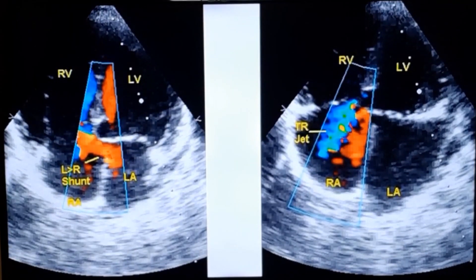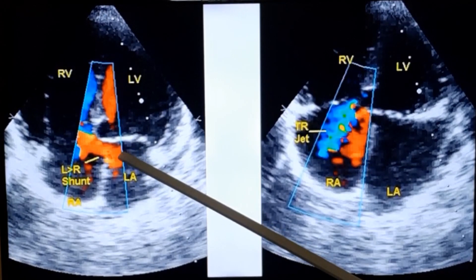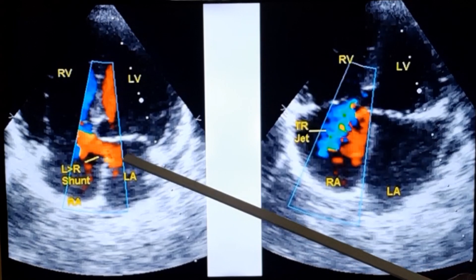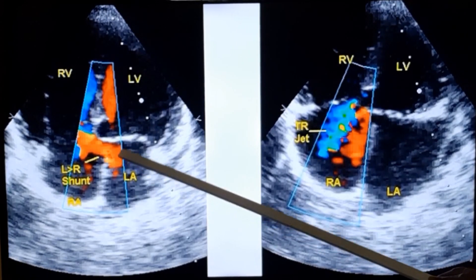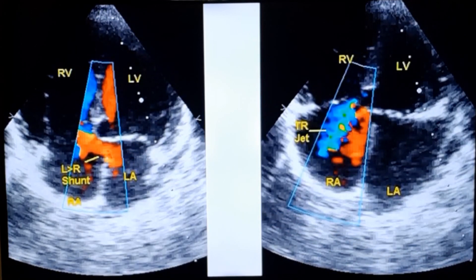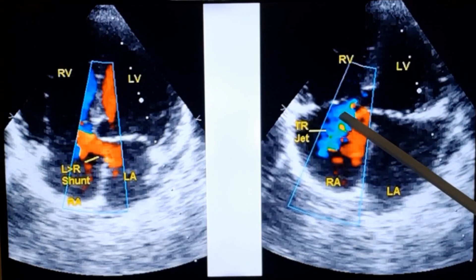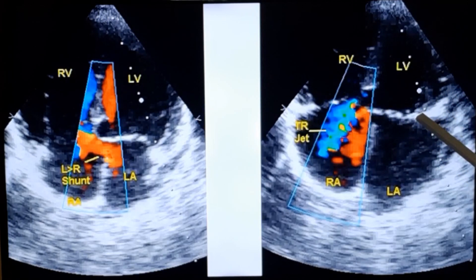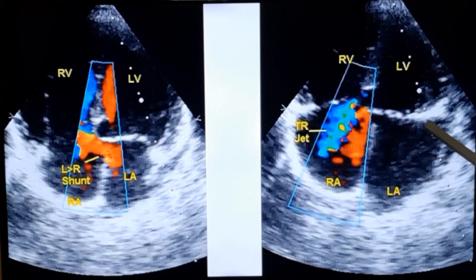This is color Doppler imaging in ostium primum ASD. You can see the left-to-right shunt across the ostium primum ASD just near the mitral and tricuspid valves. In ostium primum ASD there can be associated tricuspid valve or mitral valve disease. Cleft anterior mitral leaflet is one of the associations of primum ASD and can produce mitral regurgitation, which has not been shown in this figure.